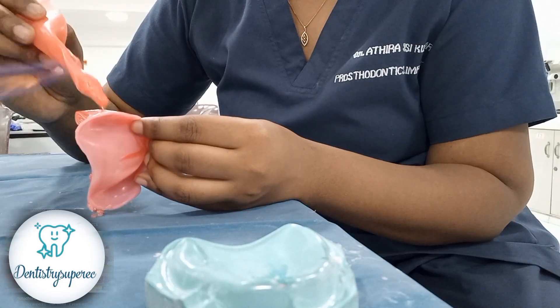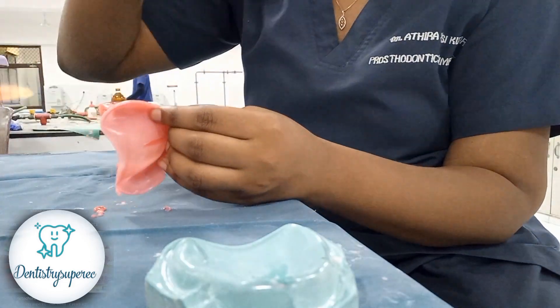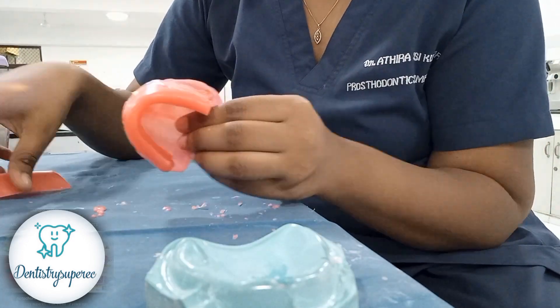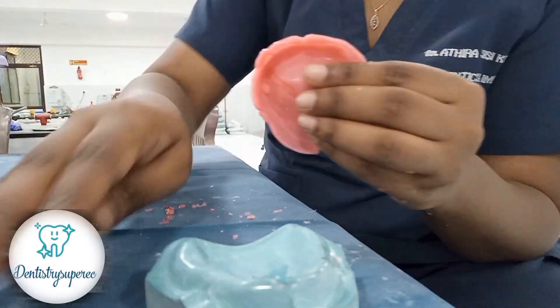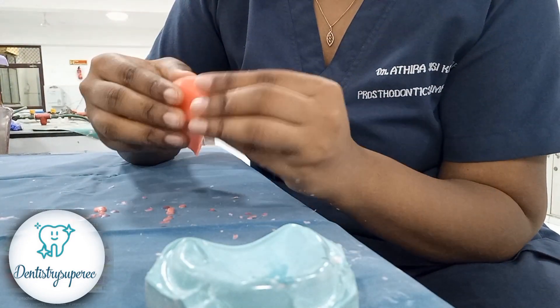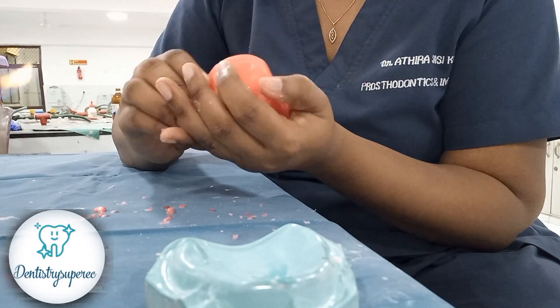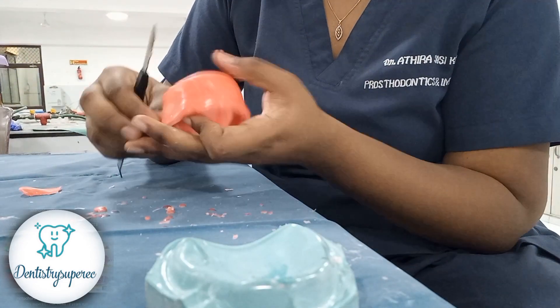For the rest of the flange areas, you can use the drop method — dropping wax onto that area — but it takes a lot of time. I'm more comfortable taking a strip of wax in the same length and adding it on by softening the wax, adding it throughout the periphery.